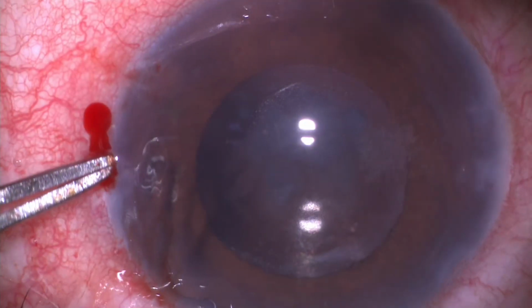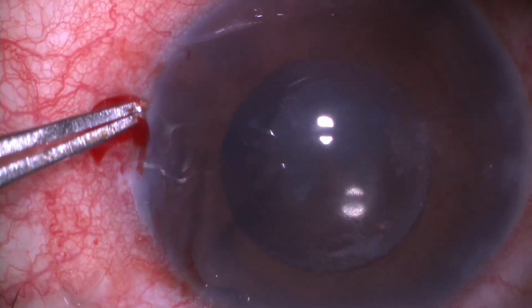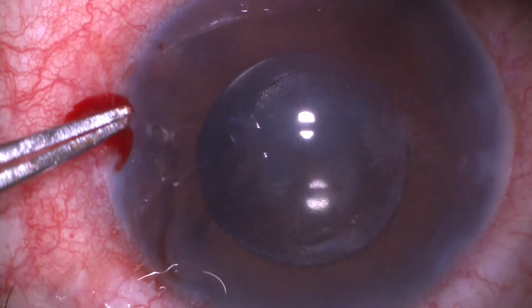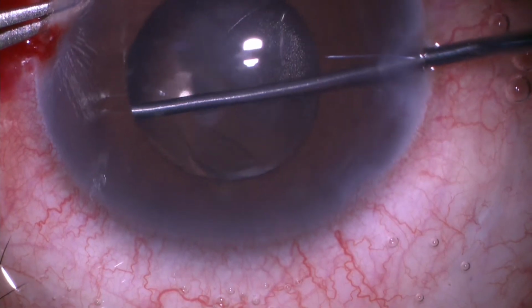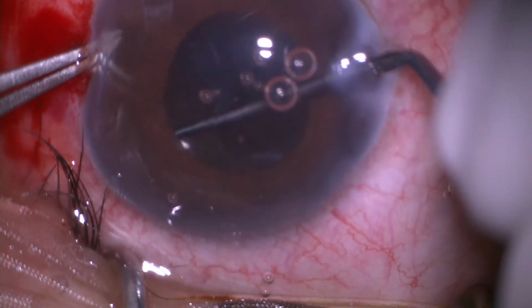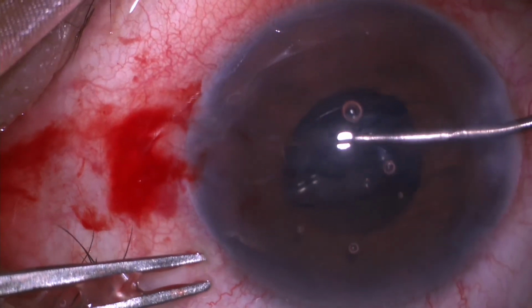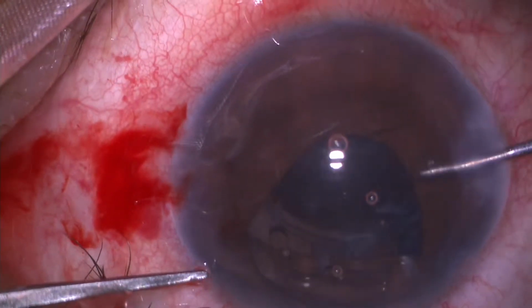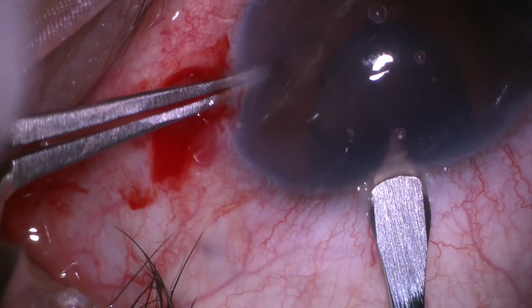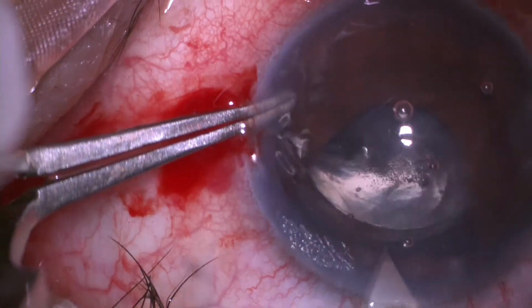In view of persisting symptoms, the diagnosis was revised and replacement of opaque IOL was planned. Due to dense adhesions, separation of IOL from capsular bag was unsuccessful. Haptic was brought in the anterior chamber. A 6 mm clear corneal tunnel was made.